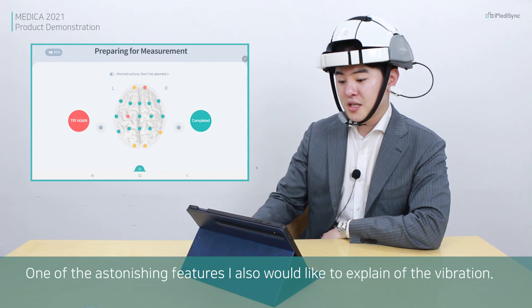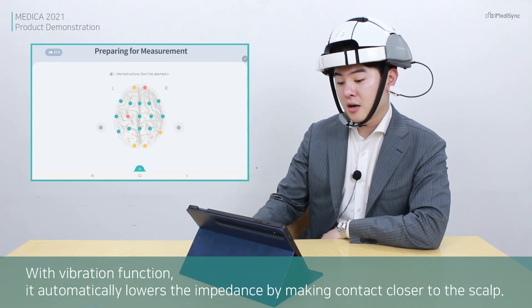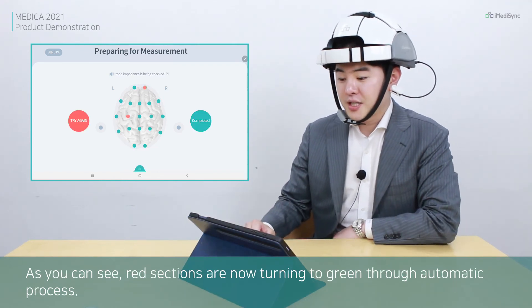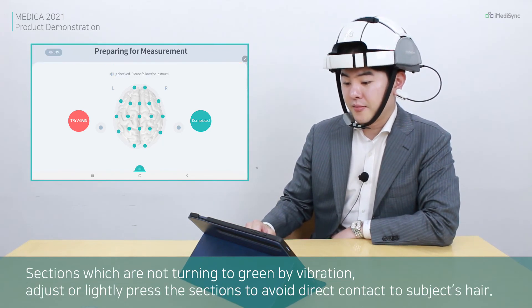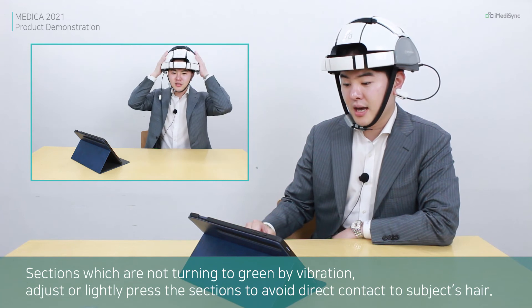One of the outstanding features is the vibration function. With the vibration function, it automatically lowers the impedance by making contact closer to the scalp. As you can see, the red sections are now turning green through automatic pulses. Sections turning green by vibration are electrodes that were previously unable to make direct contact with the subject's head.